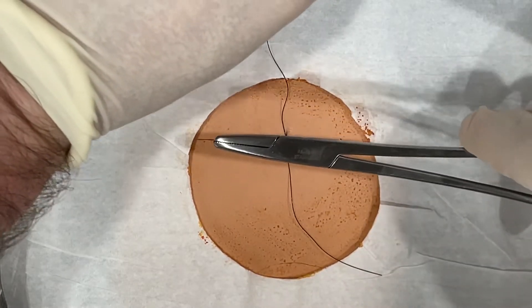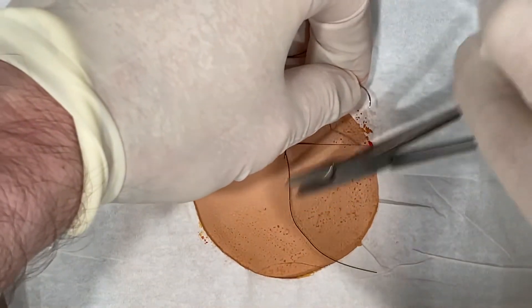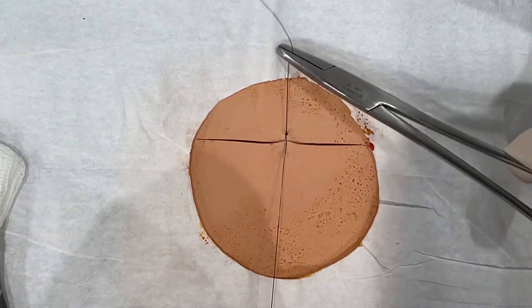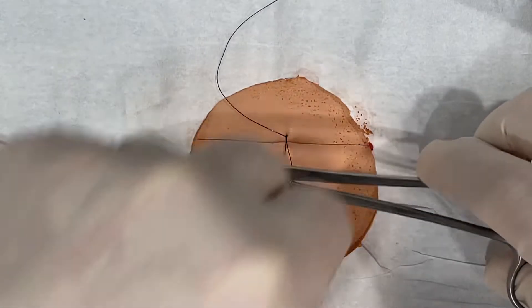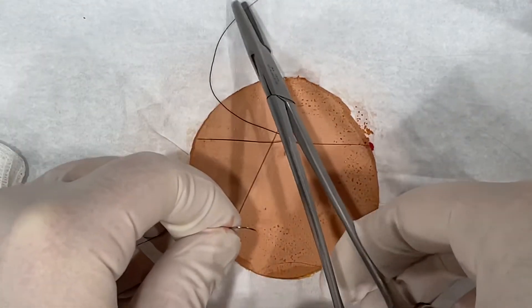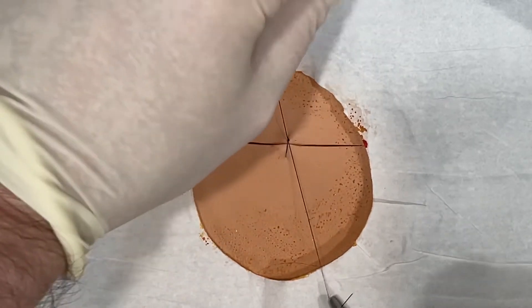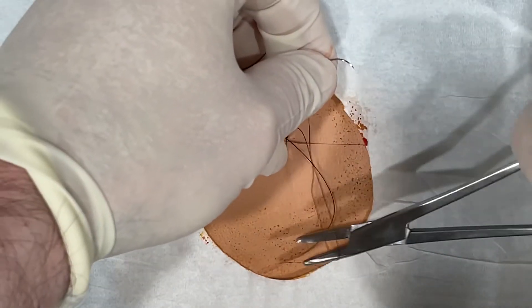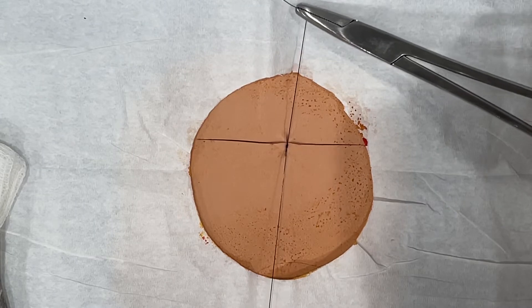Come back over your laceration. One loop, then come back the other way and pull through. Over your laceration again — one loop, grab the tail, pull through. Back over, one loop, pull away. You're alternating pulling towards you and pulling away.